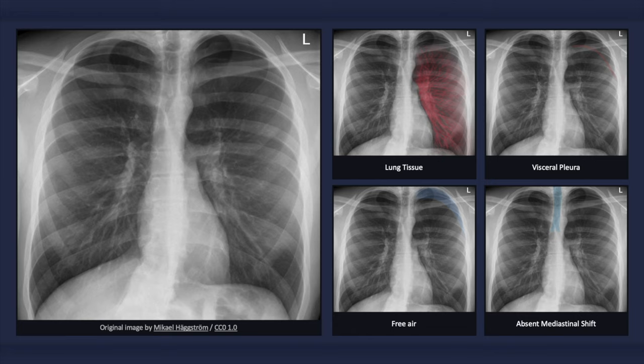When the radiograph is taken with the patient in the supine position, air actually collects basally — the anterior and lateral costophrenic sulci are the highest points in which free pleural air can collect. When air collects in this location, it may result in a deep sulcus sign, which is an indirect sign of a pneumothorax. Supine x-rays lack sensitivity for detecting a pneumothorax and should not be relied upon if negative. If the patient cannot stand, a lateral decubitus x-ray should be taken with the affected lung facing upwards.